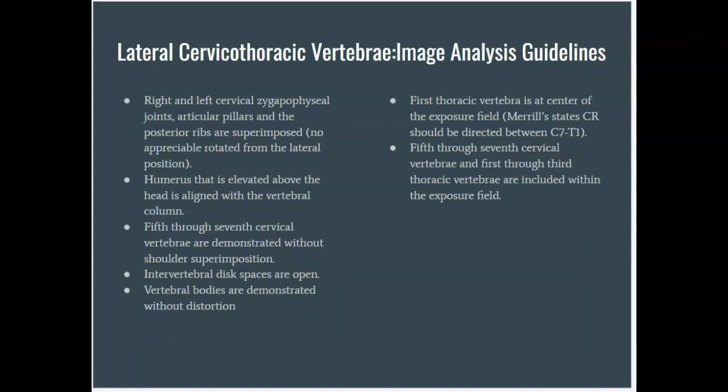As you can see, I have posted in this presentation those image analysis guidelines. Again, they're just for your additional help to complete your image analysis, as well as helping you get through understanding the appropriate projection and whether we need to repeat an image or not.